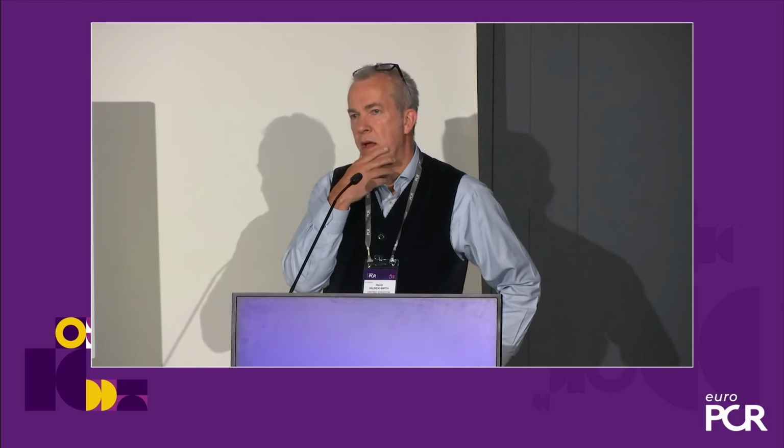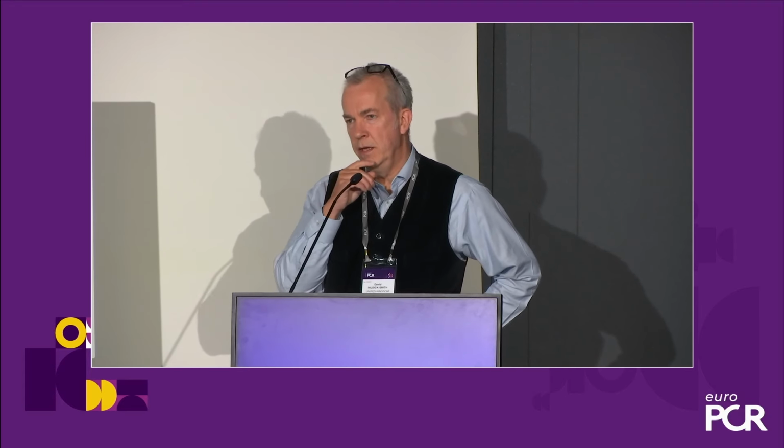Absolutely. Traditionally people have said it shouldn't be more than a type B dissection. But I've learned from Bruno and others that that may not really be the case. And Bruno can speak to this if he'd like to correct me: if you have TIMI 3 flow, and you don't have either a spiral dissection or an occlusive dissection or persistent dye hang-up at the site of the dissection, then you should be okay to leave it.